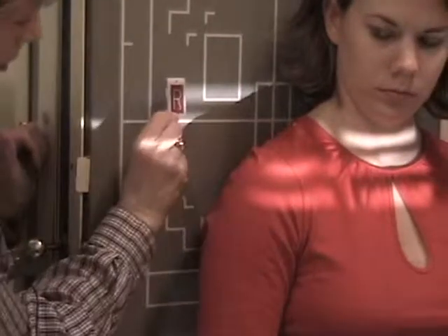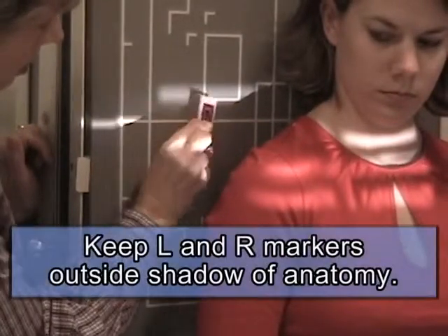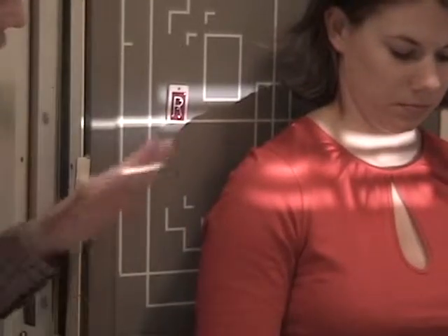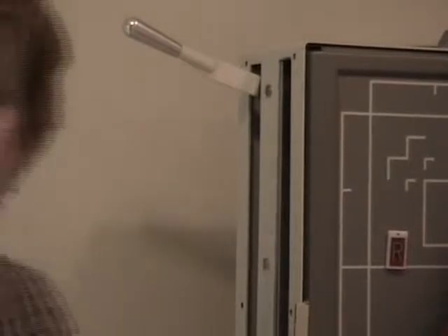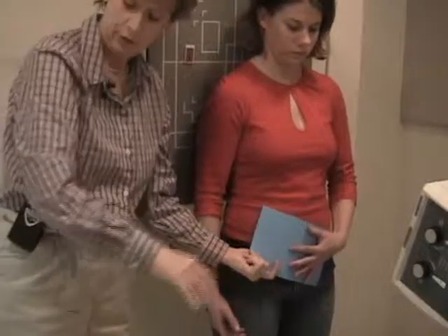here's my R marker. I make sure that it doesn't get into the shadow of anatomy. I keep it outside of the shadow, into the corner. I make sure that the patient's shoulders are in the same plane. I have her take a breath, blow it out, don't breathe, don't move, and I make my exposure. She is shielded. I don't know if you could see that at the beginning. You've got the shields we've shown you before, or you've got this tripod from your clinical sites covering her reproductive organs.